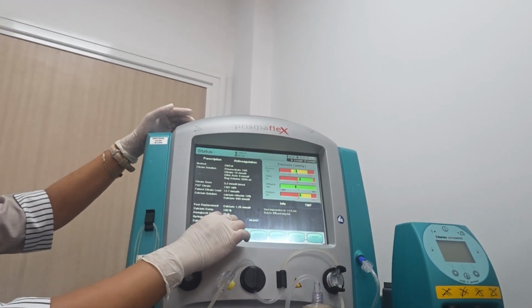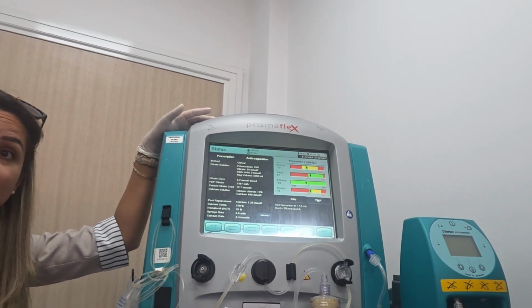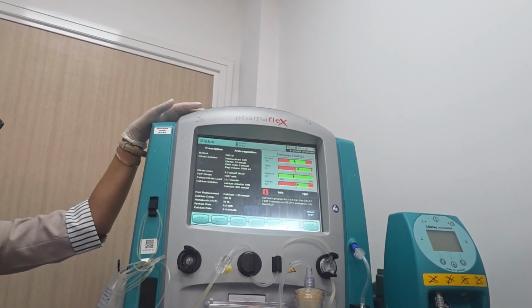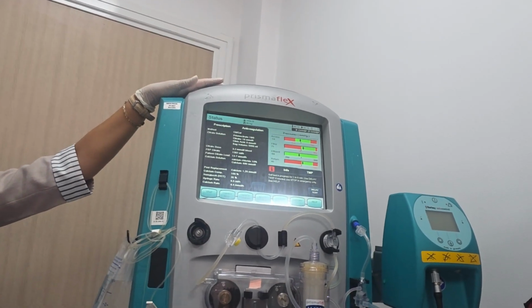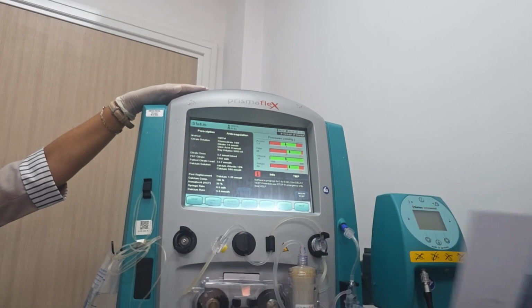Also the calcium a little bit. Why? Because I adjusted it now. I'm giving more citrate, so I should give the patient more calcium. Okay, so is it safe? It is not showing in the protocol, no? Automatically it will go up. It will go automatically. Increase the citrate. No, it's already showing.